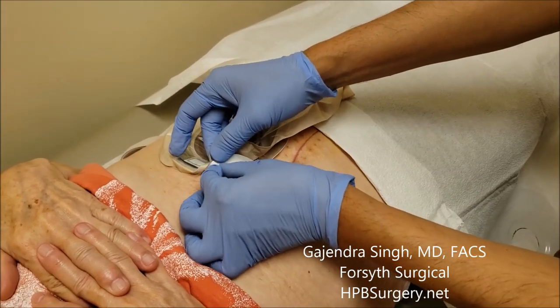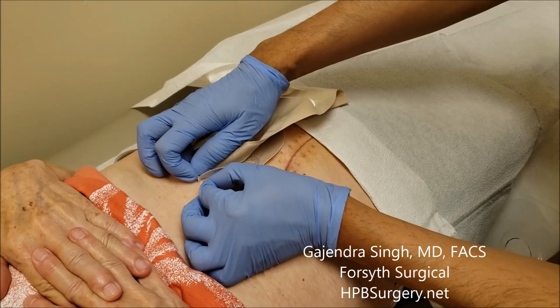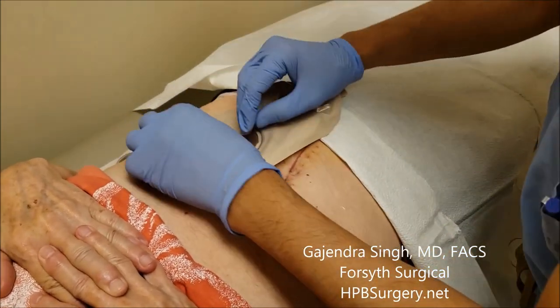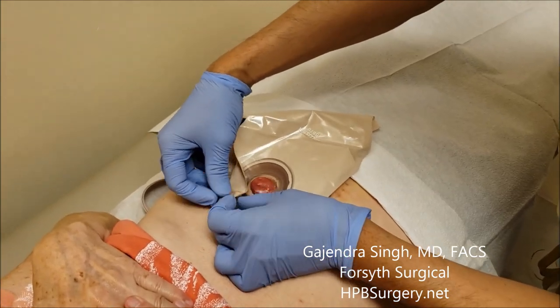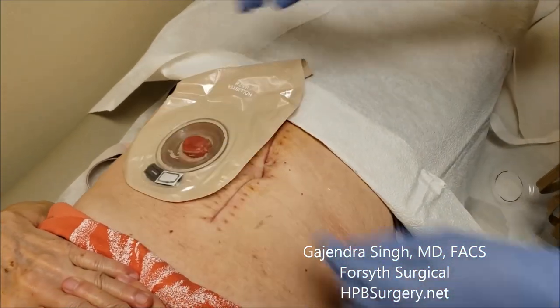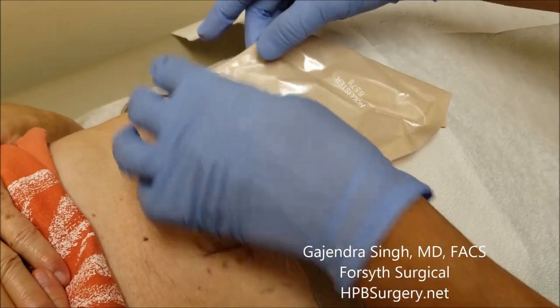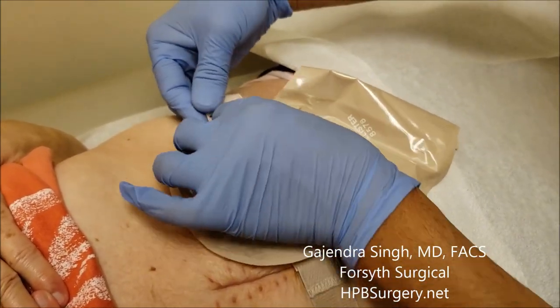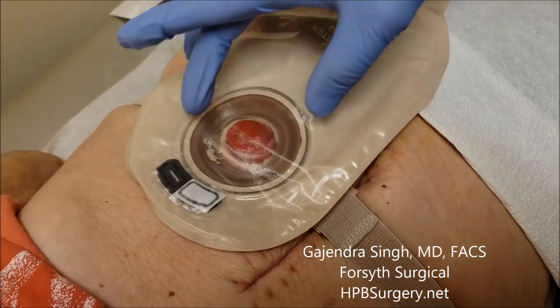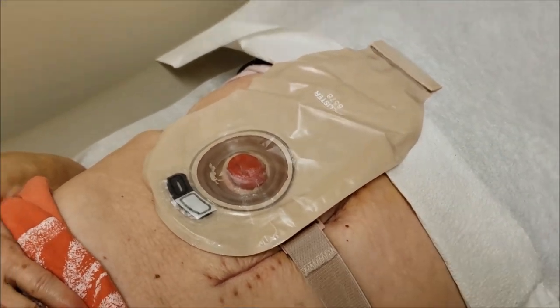Take out the hooks one at a time and put them back in on each side to hold the belt, and we're done. The colostomy bag is completely changed — she's got a new bag, and it should last at least five days, possibly more, depending on how the bag is performing.